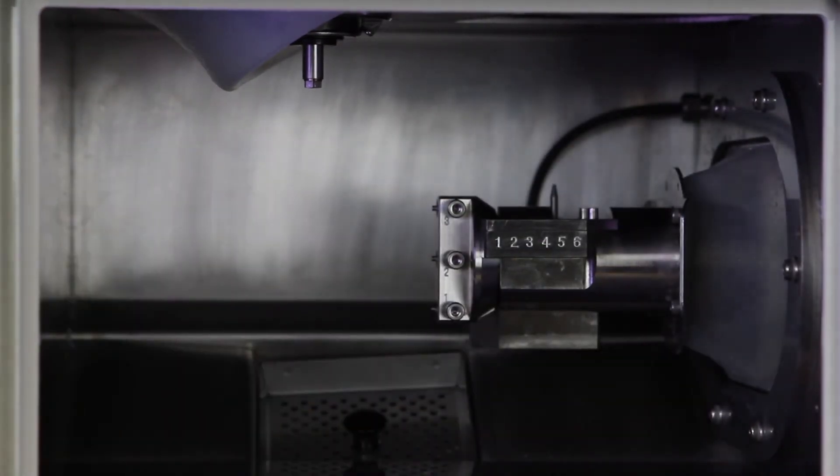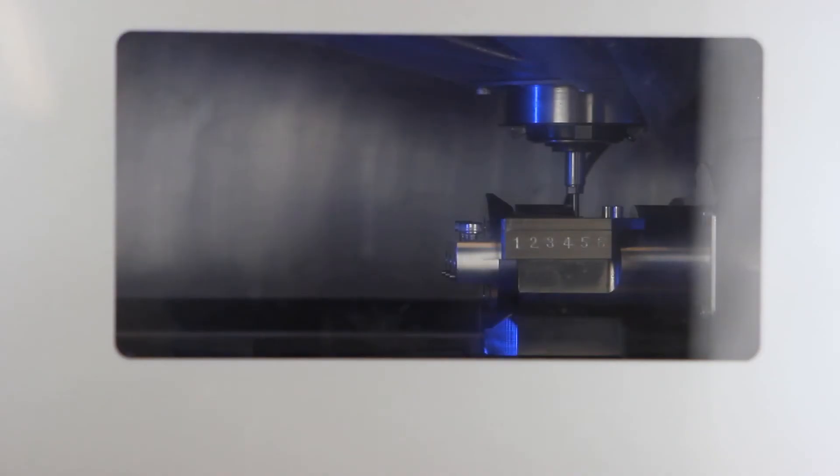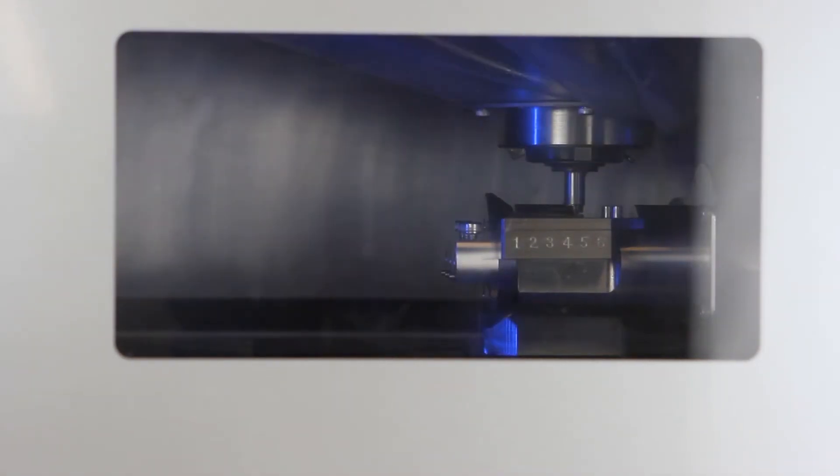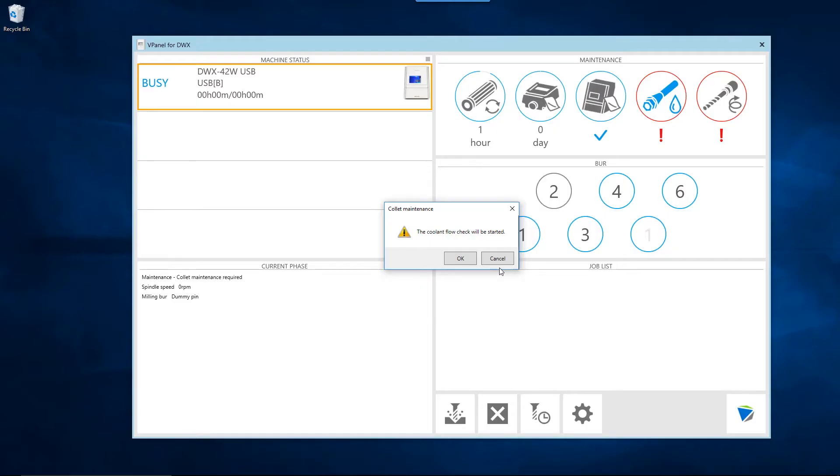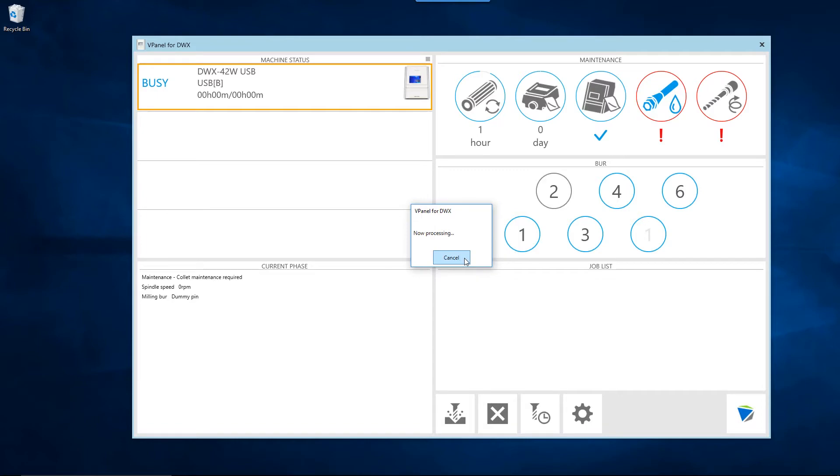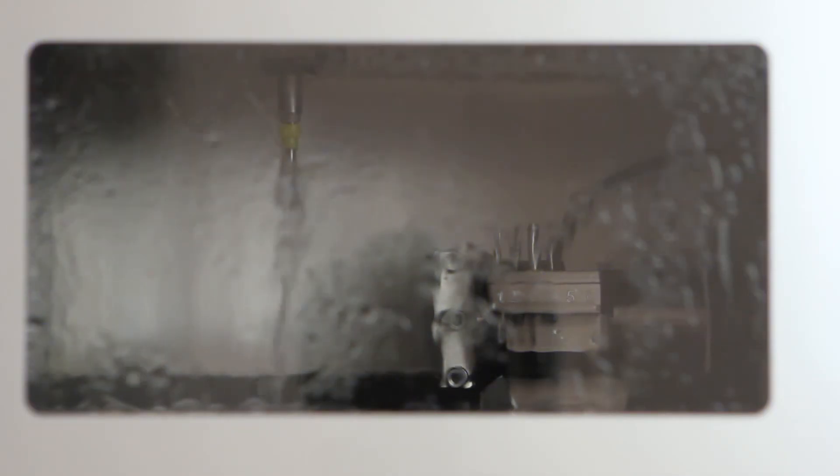Close the front cover. Your DWX mill will place the dummy pin back into the spindle head and request to test coolant flow through the coolant nozzles. Click the OK button to continue the operation. The spindle will move into a visible position so the coolant flow can be checked.